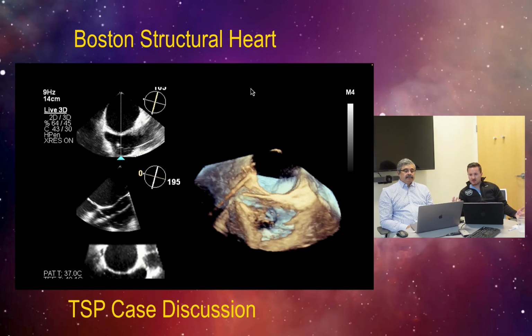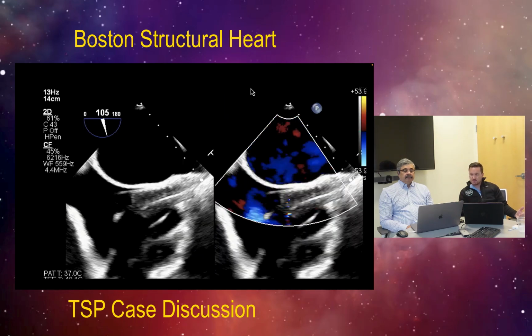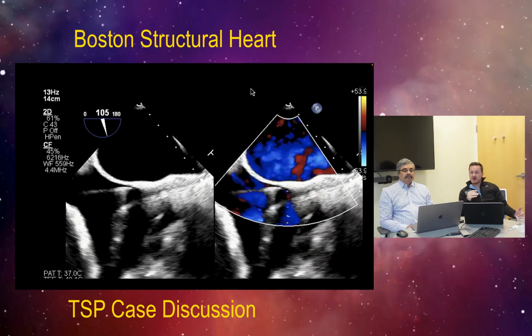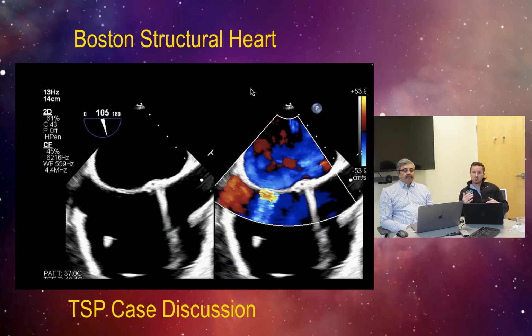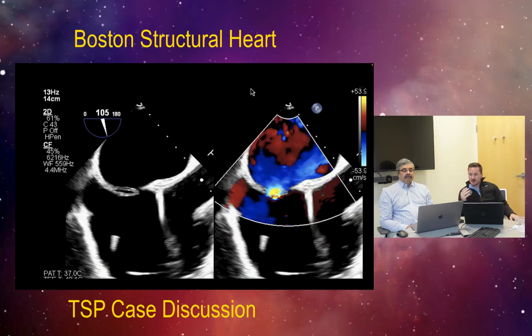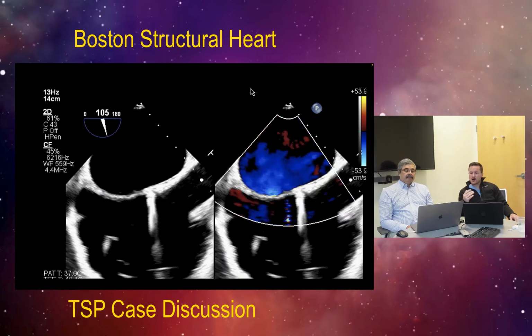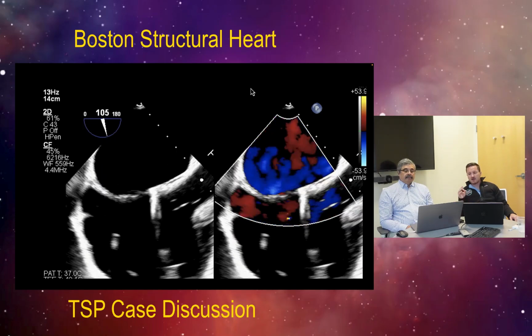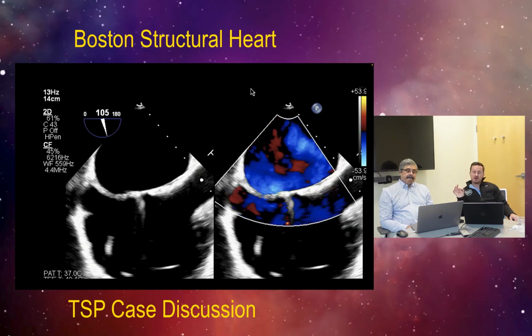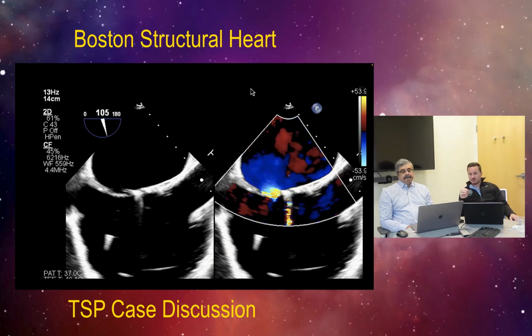We have identified the ideal omniplane angles for our bicaval and short axis views. We've also tracked the needle so we know it is coming from the IVC. We can see this patient has some other hardware in the right atrium. We can see the site of the previous iatrogenic ASD. The procedurist is now starting to come down onto the fossa ovalis. And as I highlighted in my previous statements, we're looking at the reverberation artifact of the trans-septal puncture needle here. And this is the tip of the needle here.